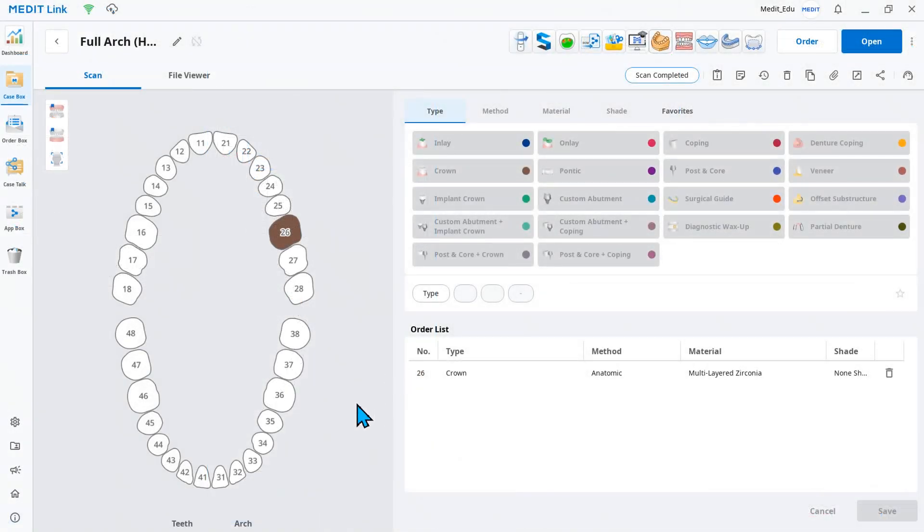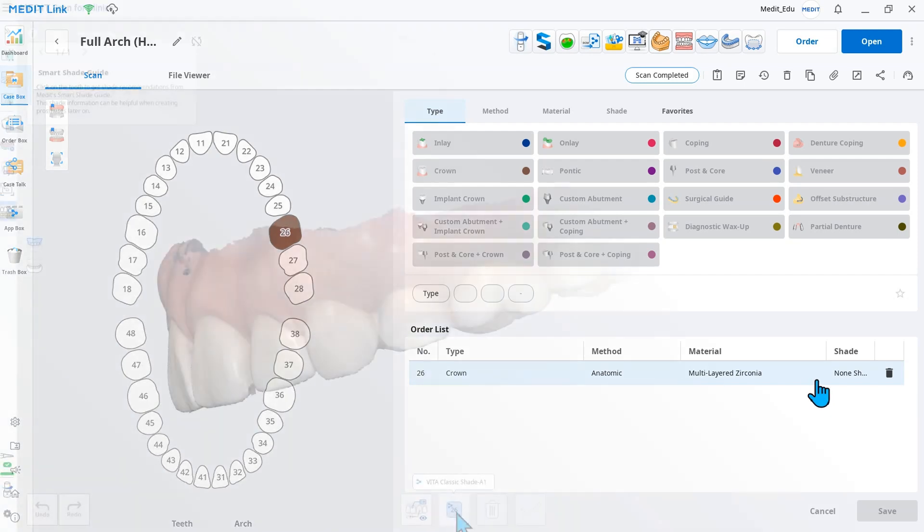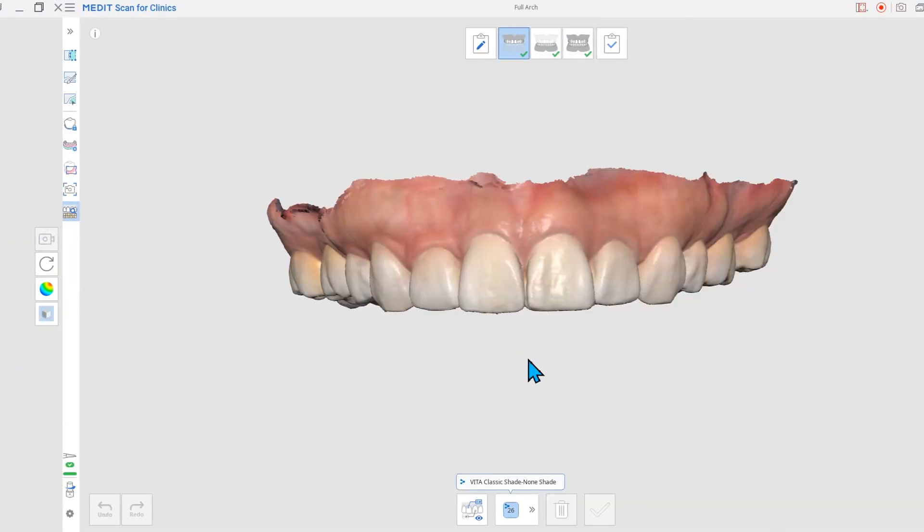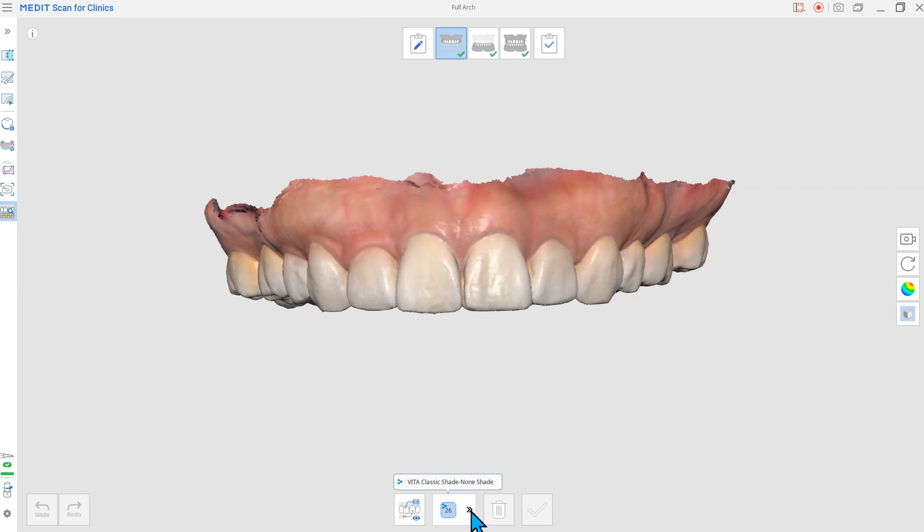When working with these tools before, only the teeth initially registered in the form information were displayed below. In the updated version, you can select any tooth number regardless of the form information.